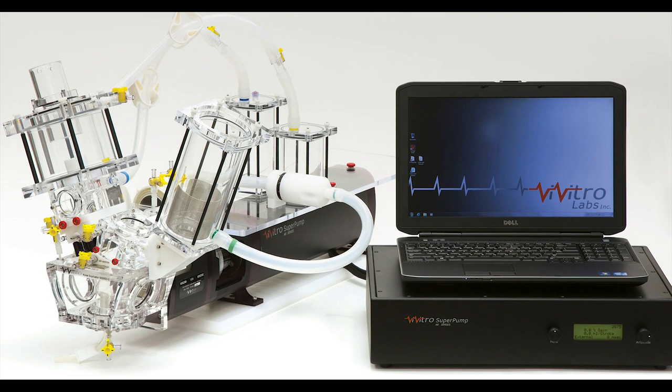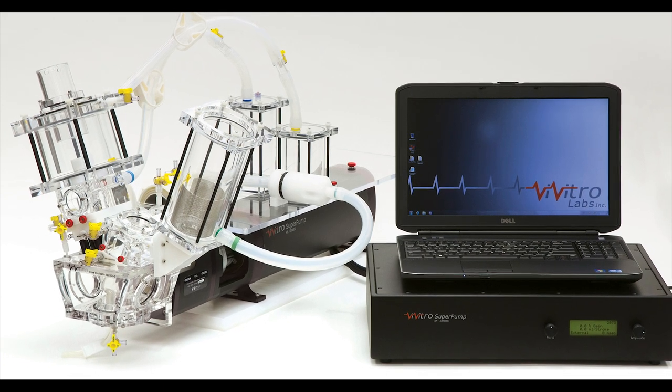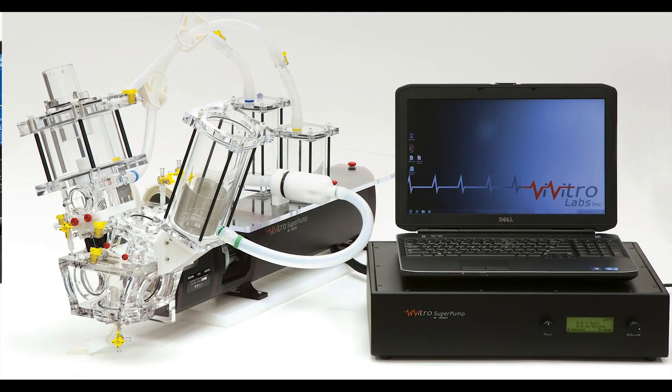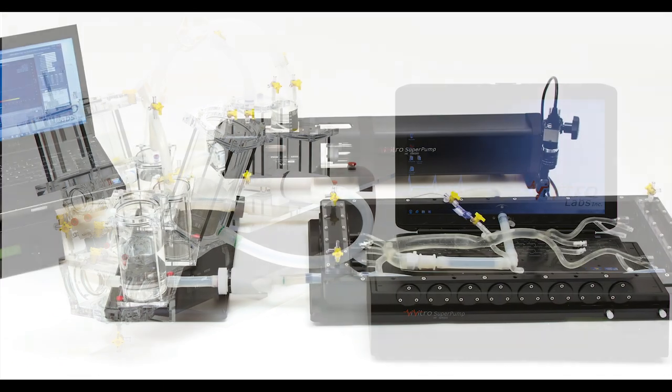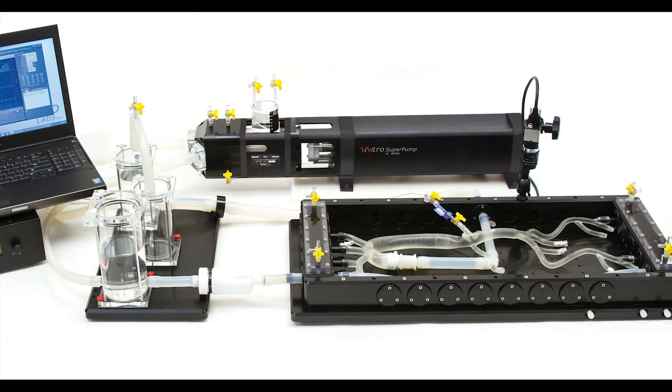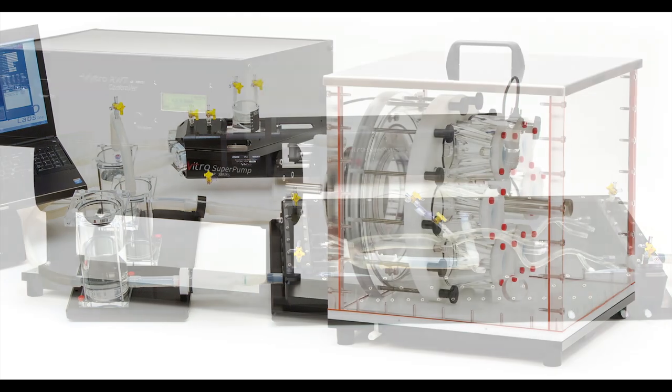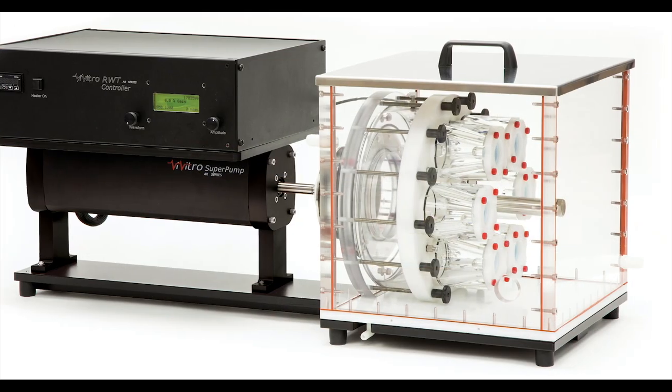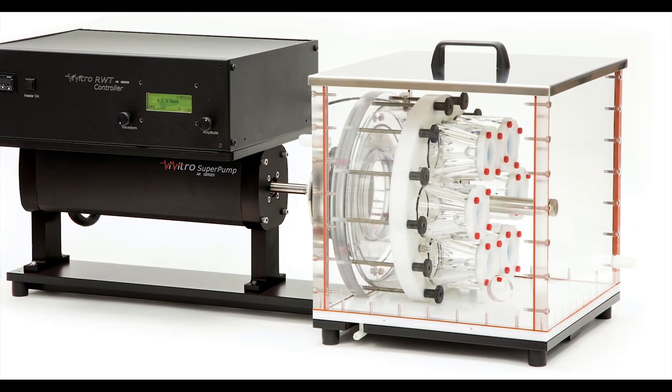It is the foundation for the Vivitro Pulse Duplicator, Endovascular Simulator, and Real-Time Wear Tester.